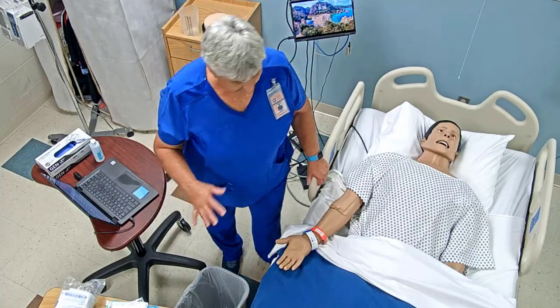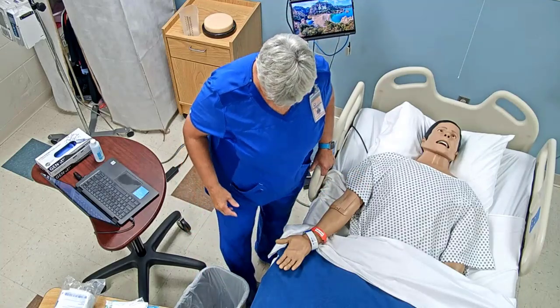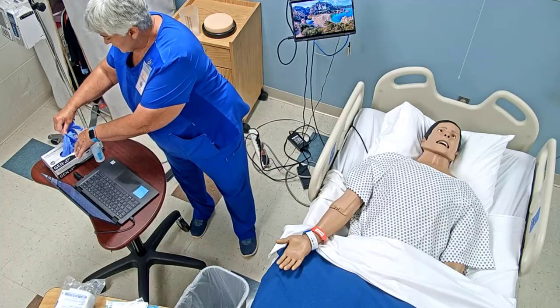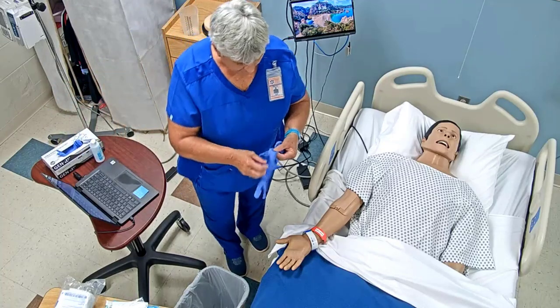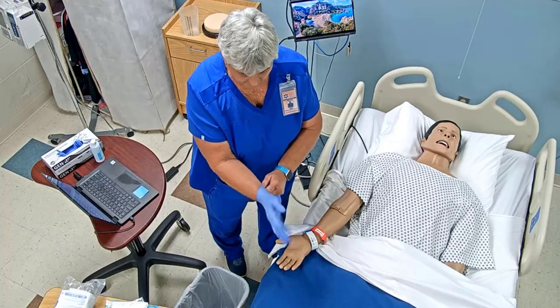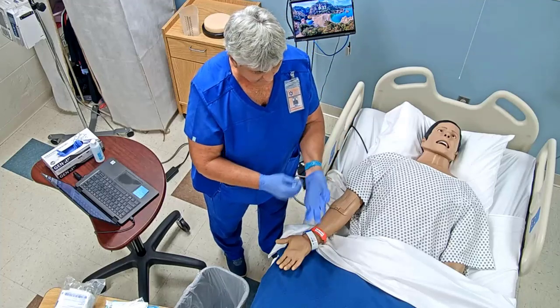Okay, so again, privacy. Got the bed in a good working position. I've got good lighting. I'm going to put my gloves on. I washed my hands when I came in the room. So I'm going to need to position you. Did you have any questions about what I was telling you we were going to be doing?